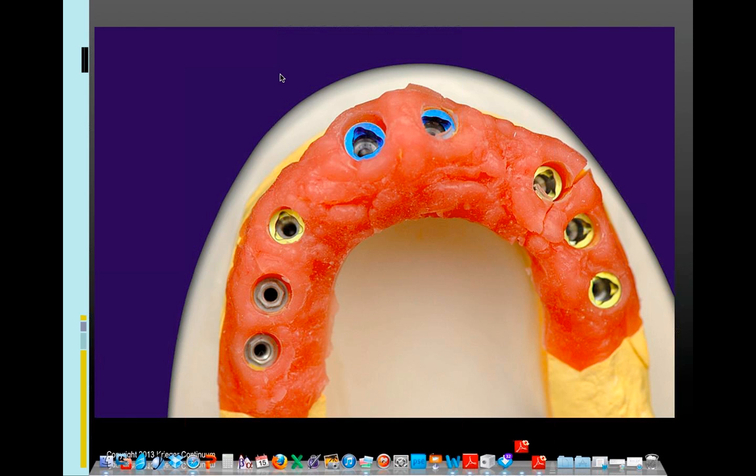Well, I hope you're cleaning your articulators before you show them to patients at case presentations. And I think if you're doing that, you should also have pretty clean looking images when you present them to patients. And as those of you who sat through my first 2 webinars know, the key to digital co-diagnosis, which is different than digital case presentation, is exceptionally clear images that you can present to patients so they can help diagnose what's going on. And an image like the one that you see in front of you right now is certainly very, very helpful if you're ever going to teach or in a study club, or you just want to show people how to do things.